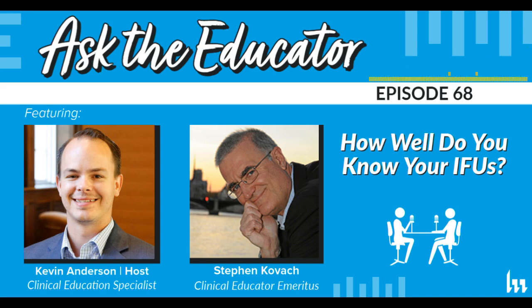It's one of those things that you see all the time and everywhere, and you get so used to using them. But to your point, yeah, they're definitely not paying attention to how much they should be coiled. They're oftentimes not tracking the amount of uses. I've been to only, I think, one facility that was tracking uses, which, wow, that's pretty impressive. Yeah, most of the time you do not see that, even with instrument tracking systems.